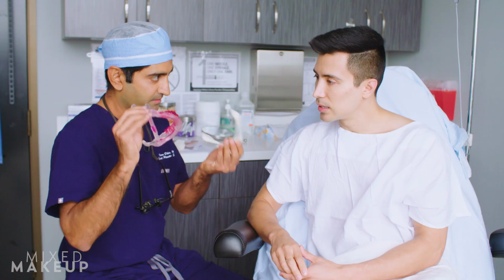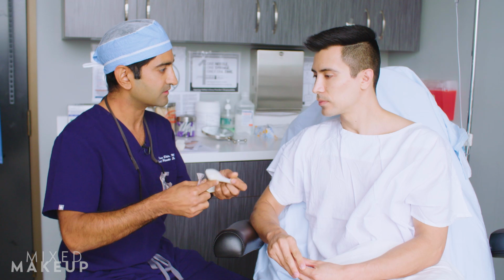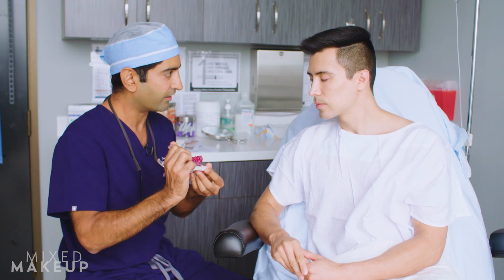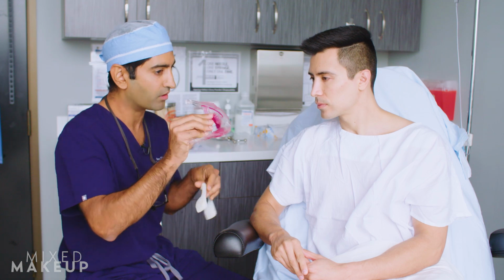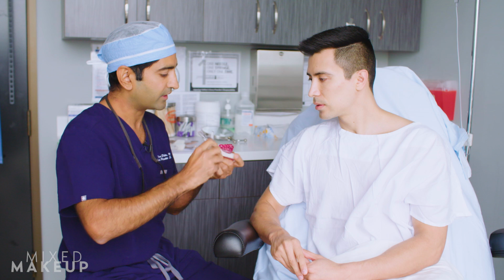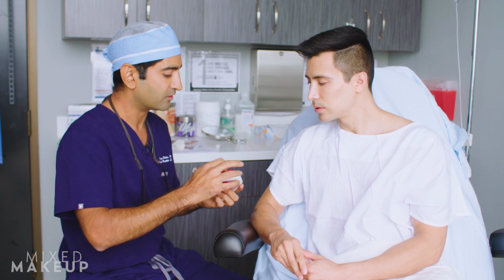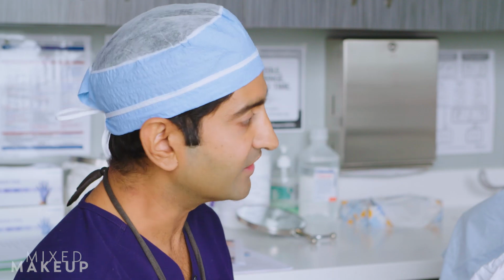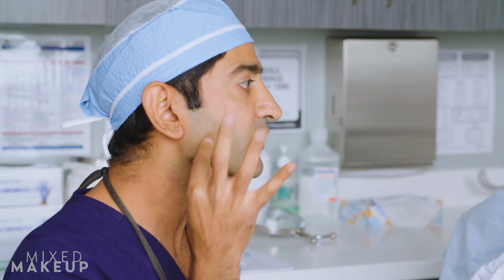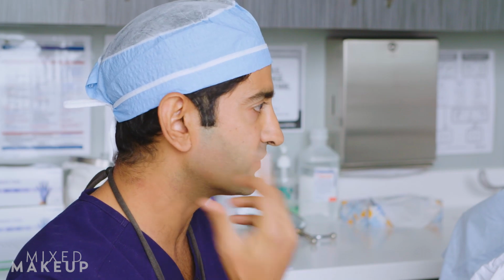Now, as you know, this is just a model. This is silicone, rubber, just like you saw the prefabricated implants. So it's not hard. It's actually rubber, and it fits to your bone. It's custom made to your bone, so it actually snaps on. Because it's rubber, I will put a little screw right here and here. I know where the nerves are based on the model, so it'll just be away from the nerve. This is that nerve we've got to kind of watch for, but I know where it is now visually. When it heals, it actually feels like bone. If you dig and look for it, you'll find the contour, you'll know it's there, but no one else would, because it just feels like bone.